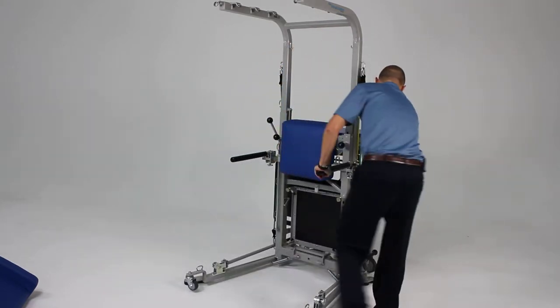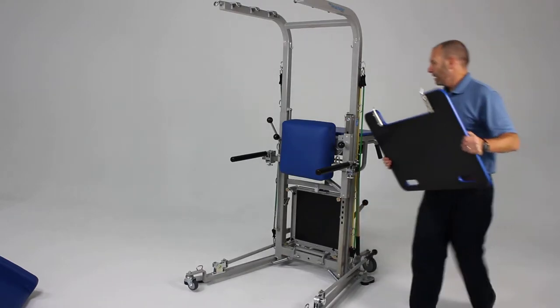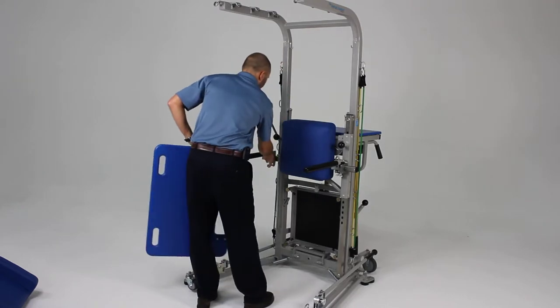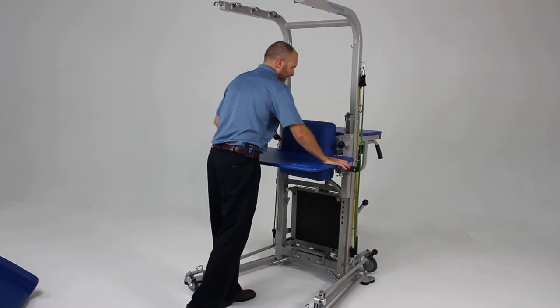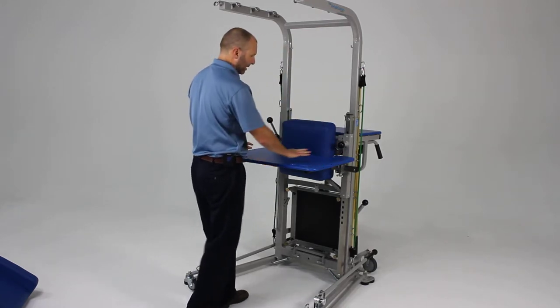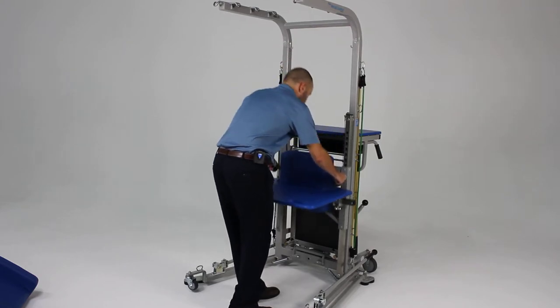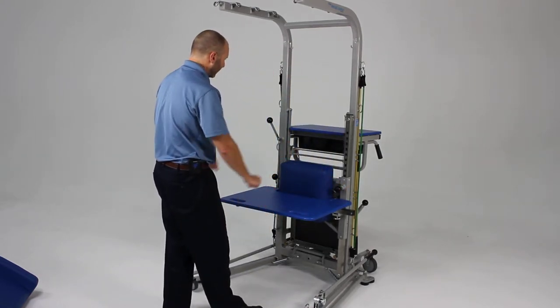The table or bench can be added to the front of the unit by simply placing it under the tabs here and putting it in place. It can be used as a standing table or lowered, and a wheelchair can be pulled up underneath the unit so exercises can also be done in a sitting position.